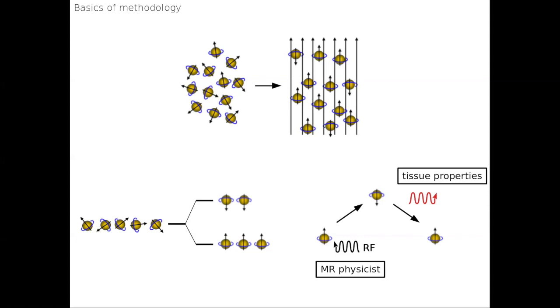So what we will see depends on one side on the MR physicist, but on the other side, of course, on the tissue properties.